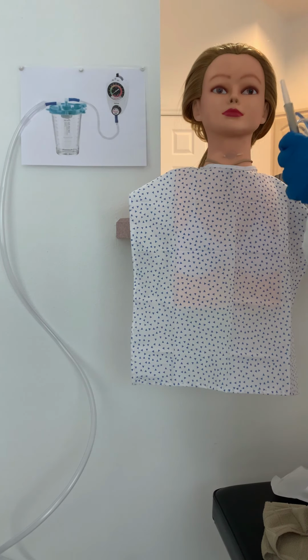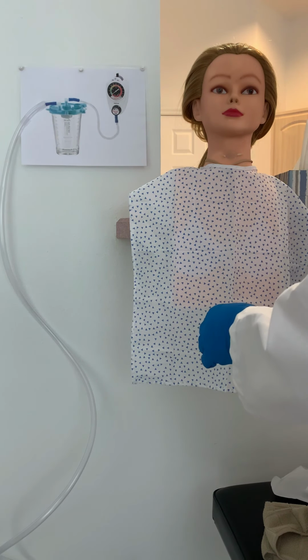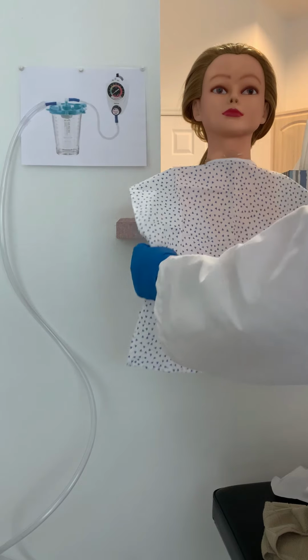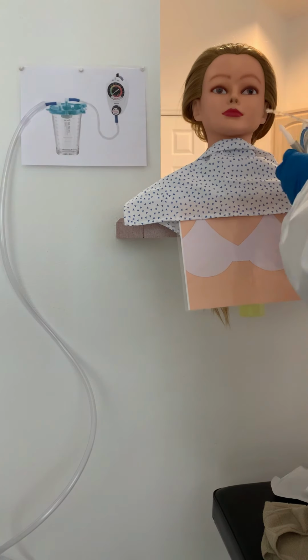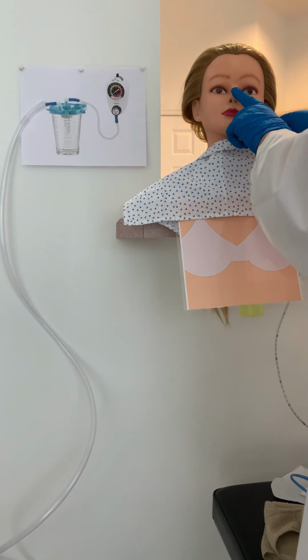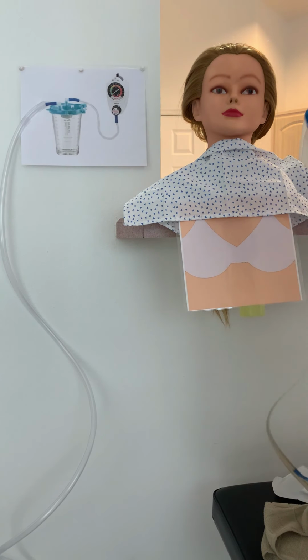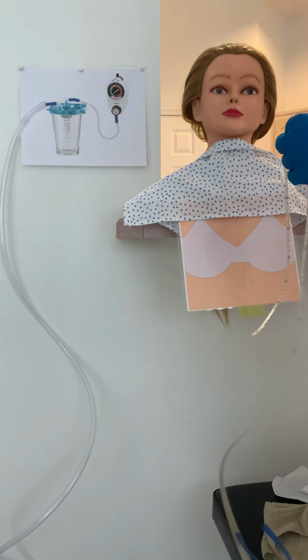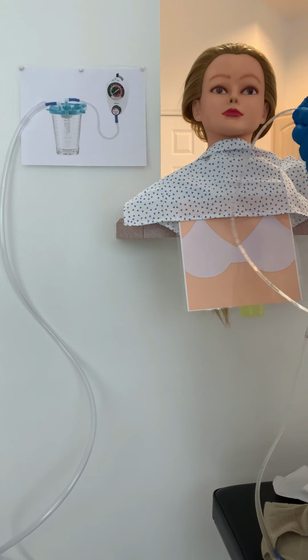Okay, so I just need to measure this to make sure that I know how far I need to go in. So I need to measure under your gown, so I'm just going to lift your gown up here for just a minute, and then I'll put it back down again. So I'm going to measure from the tip of the nose to the earlobe, and then down to the xiphoid process. And I'm going to mark this place using a piece of tape. So we'll go ahead and put a piece of tape there where I was holding.